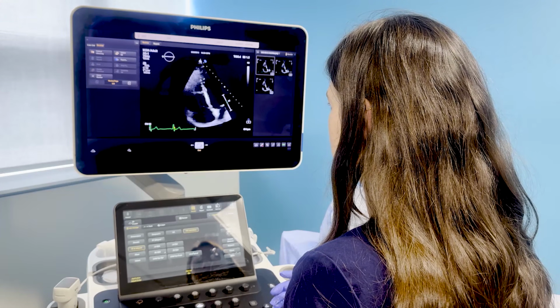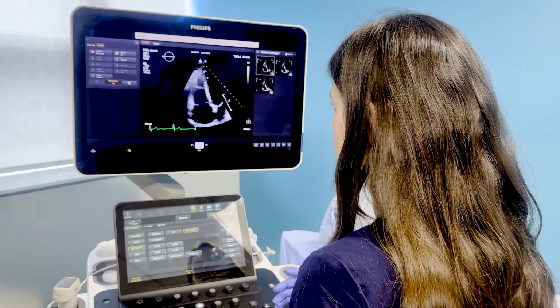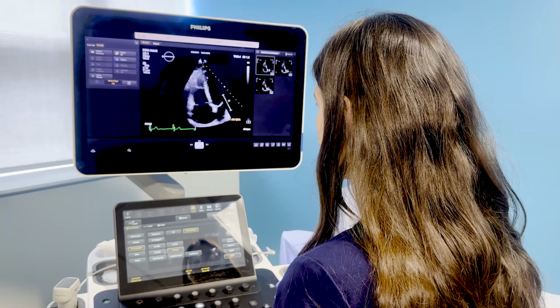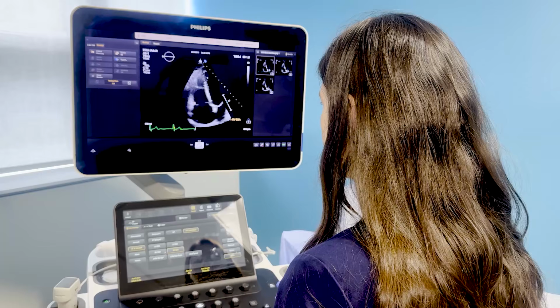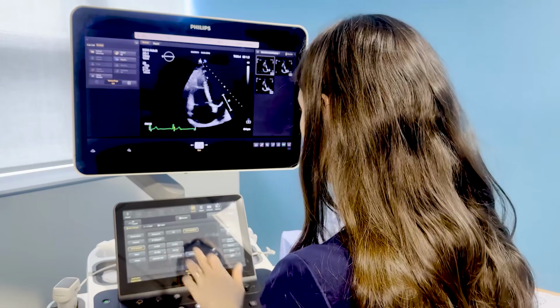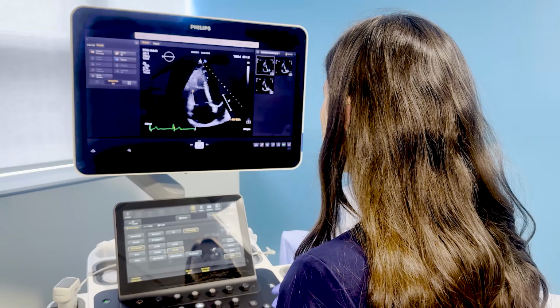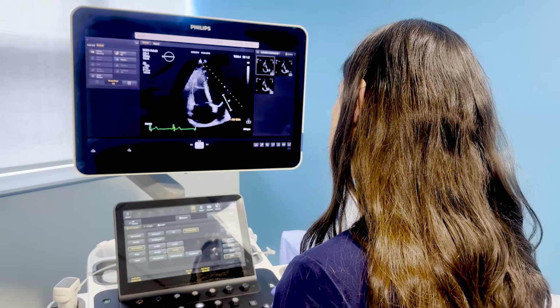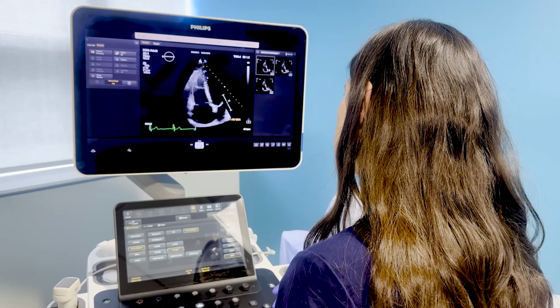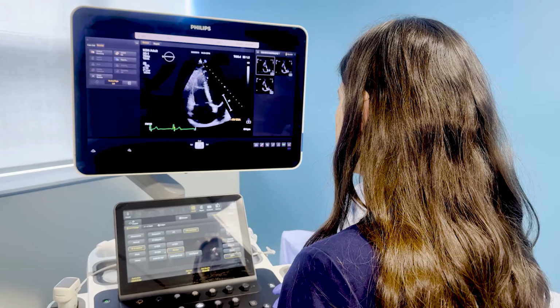So then I'm going to come in systole just before the valve opens. So I'm going to do the same thing. I don't normally trace on the machine. Trying to not include any of the moderator band. Okay, so that's great to see you've left out some of the moderator band there and some of the trabeculations as well.